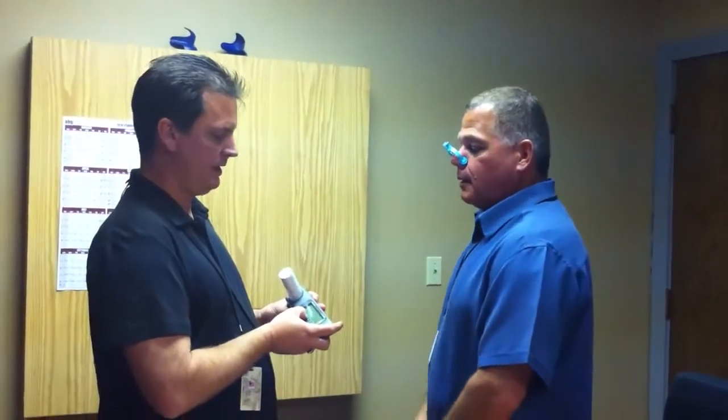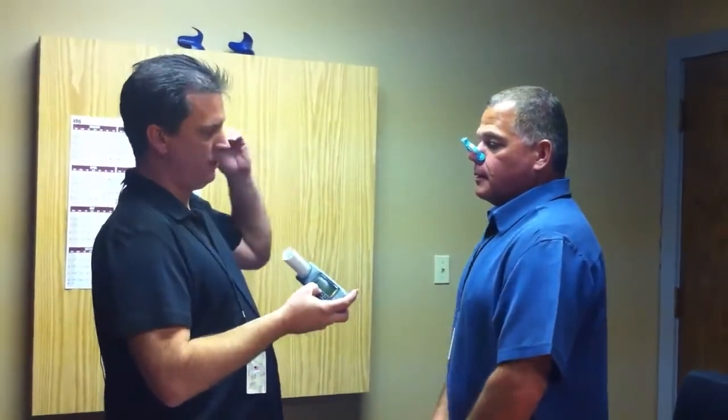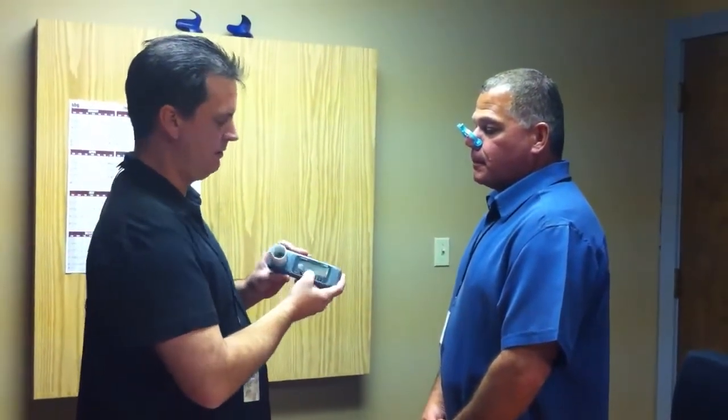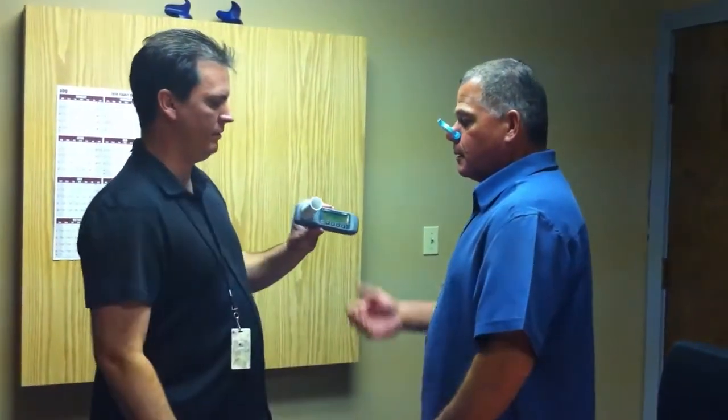To begin the test, we're going to hit the ramp triangle, and we're going to take a deep breath in, and we're going to blow out for a total of six seconds. And we're going to hear a long beep at the end. At that point, you're going to take a deep breath in, and the test will be complete, and I will coach you through it whenever you're ready.